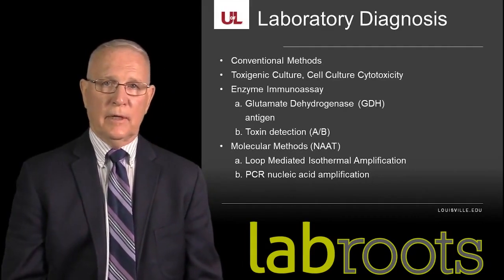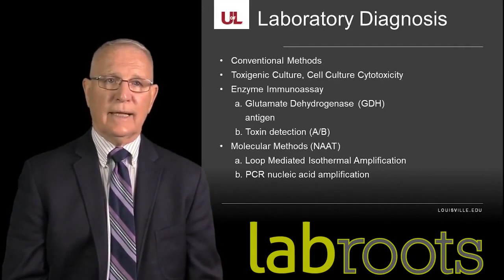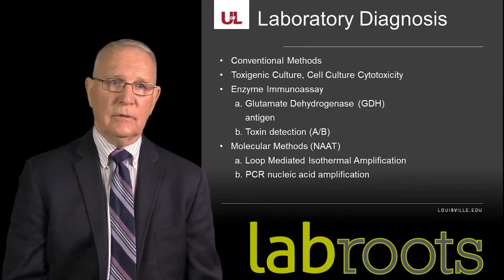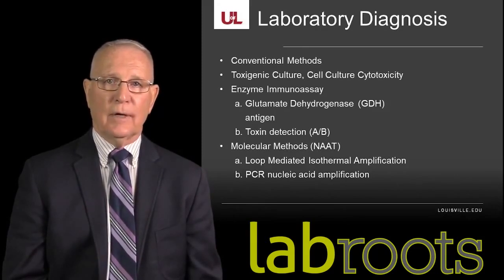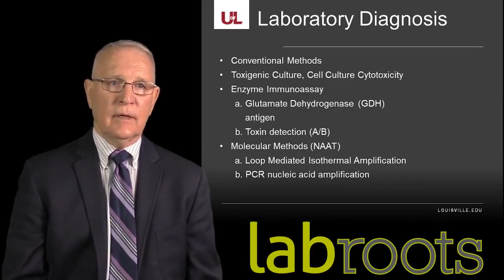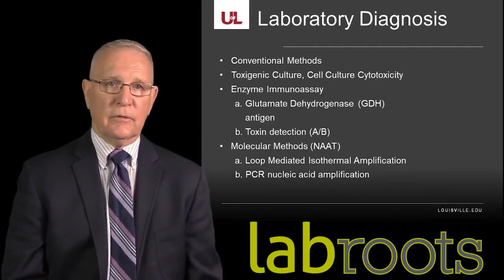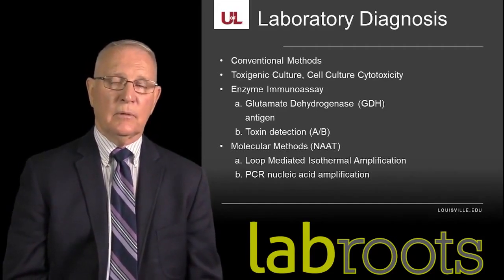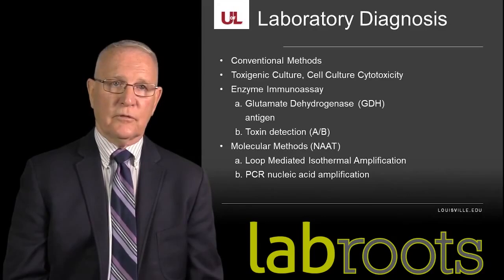Then we have molecular methods, sometimes referred to as NAT, nucleic acid amplification tests. Two of the most prominent NAT tests are loop-mediated isothermal amplification, and the other, most prominently used, is PCR nucleic acid amplification. Both systems are molecular in nature and are capable of detecting toxigenic Clostridium difficile.